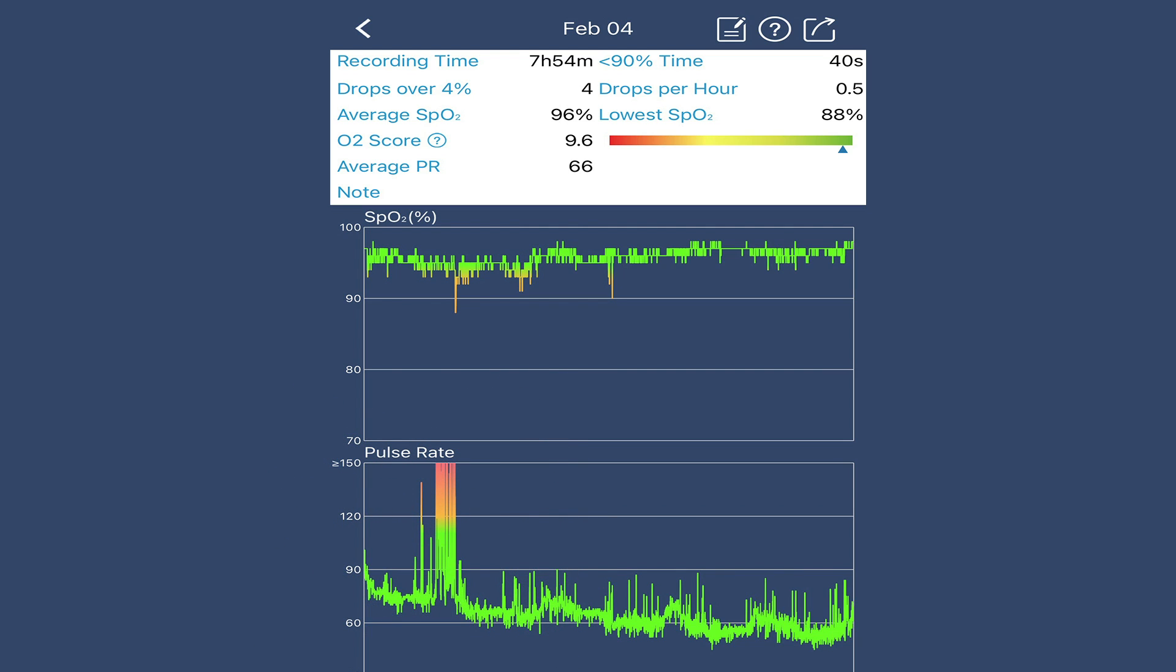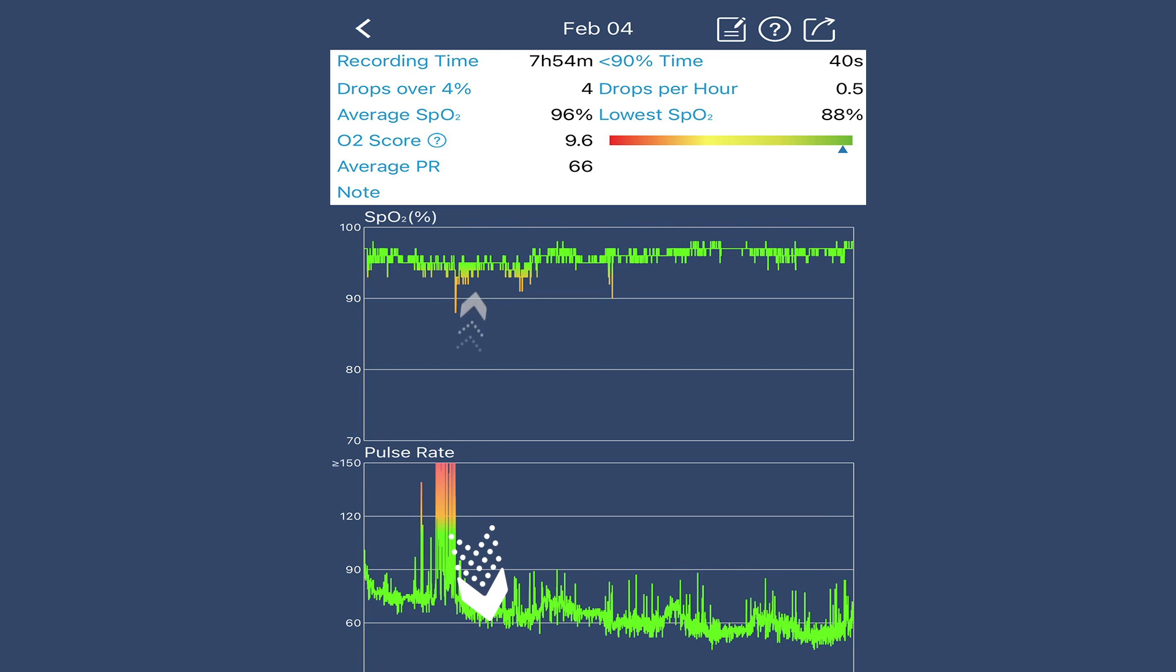And then we've got drops per hour. This is kind of like your apnea hypopnea index, like how many times per hour you're having events, apneas, hypopneas. And then the lowest oxygen level that it went down to, 88%, which is right here where it triggered it off. So I really enjoyed doing this. I'm going to do it again tonight because I'm fascinated to see how this went. But at the same time, I'm very interested to see this really high pulse rate here coupled with this oxygen desaturation. And that ring did wake me up. It did its job. And I was on my back and I rolled onto my side. And obviously, when I rolled onto my side, my heart rate dropped right down and my oxygen levels went back up again.